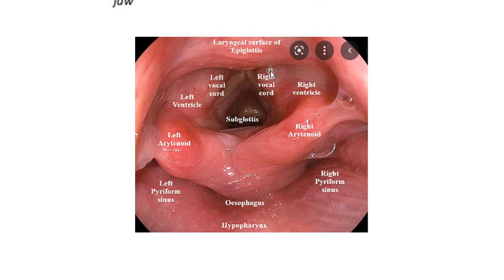These pink colored mucosal folds are called vestibular folds, whereas the white colored folds, if you ask the patient to speak, will move. The white colored fold which is moving is called the vocal cords, and below that are the subglottis and the tracheal rings. Posterior to the arytenoid and the cricoid is the hypopharynx or laryngopharynx. In the lateral wall of the laryngopharynx, we can also make out the pyriform fossa. Inferior to the pharynx, there will be the esophagus. So this is in detail about direct laryngoscopy.